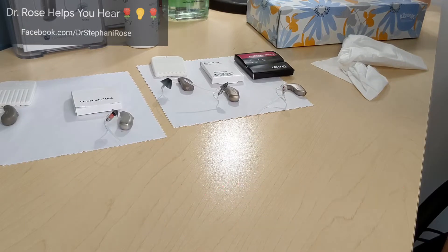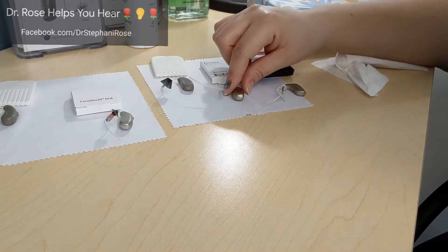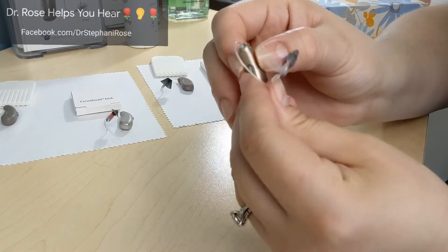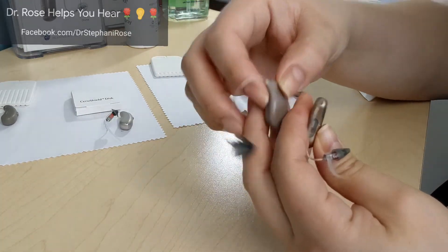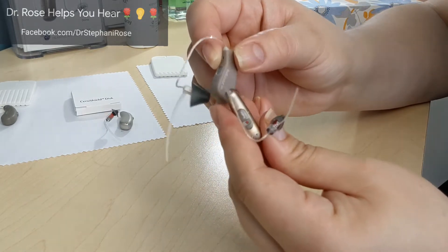Welcome back to Dr. Rose Helps You Hear! Right now I'm going to talk about the older Phonak receiver-in-canal hearing aids — this is a rechargeable version — and also the ReSound receiver-in-canal hearing aids. This also works for Widex receiver-in-canal hearing aids.